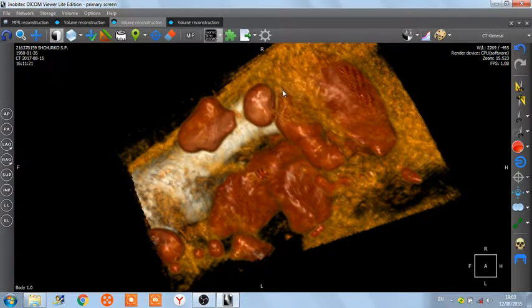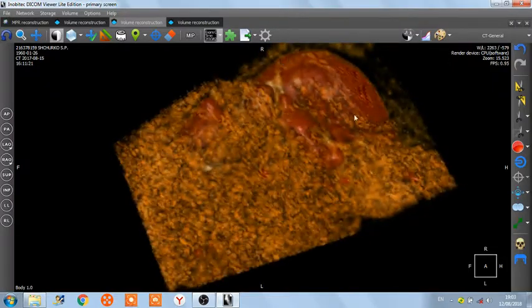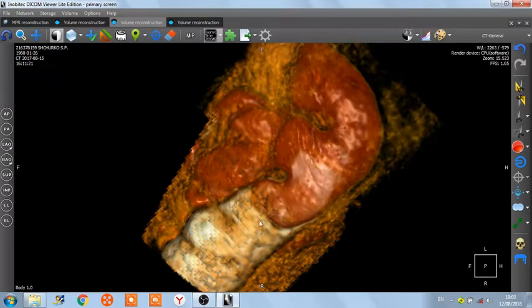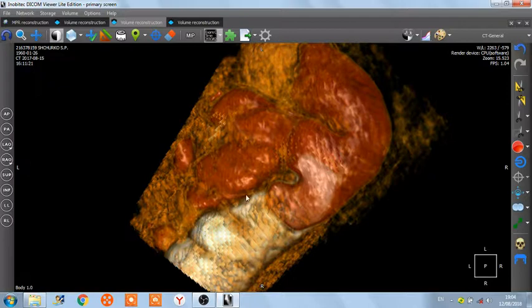So we can see the middle one, the biggest one, and those air which locked in the colon, that one, that was joined to continue with the colon. And you can see how squeezed they come in to each other.